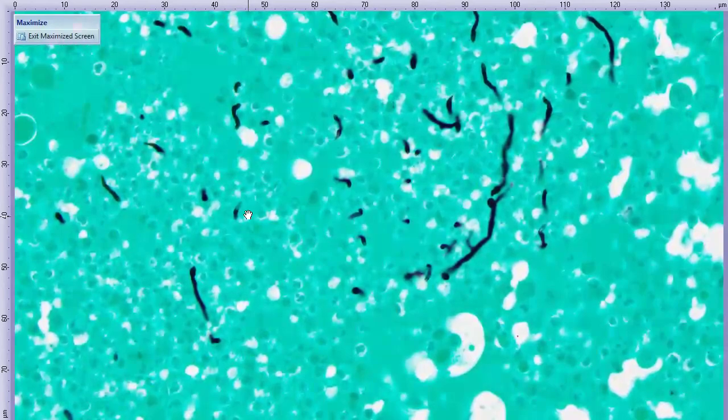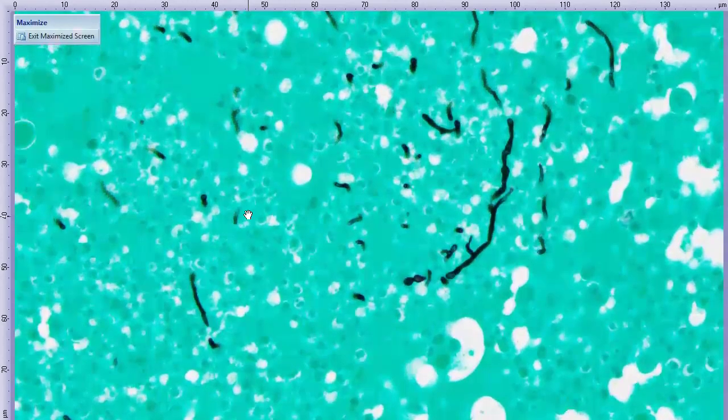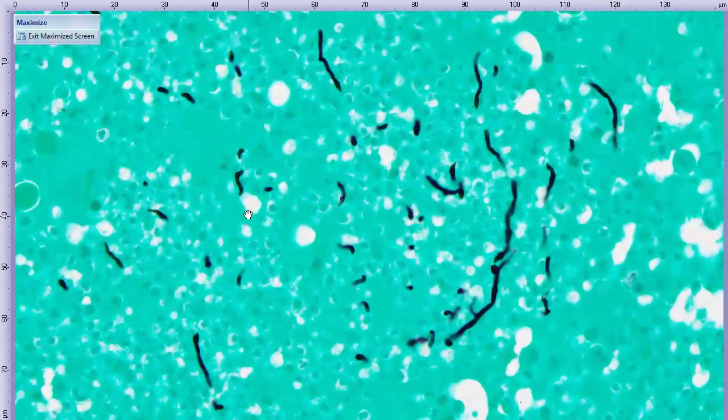And she did note that the cat did have a chronic rhinitis that they suspected to be herpes virus related. But it sounded like maybe after they enucleated, there might have been more mucopurulent discharge. So wondering if maybe there's also some nasal involvement with this fungus. Sinus involvement, yeah, as well.